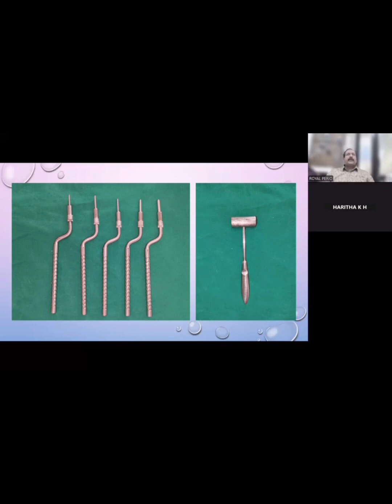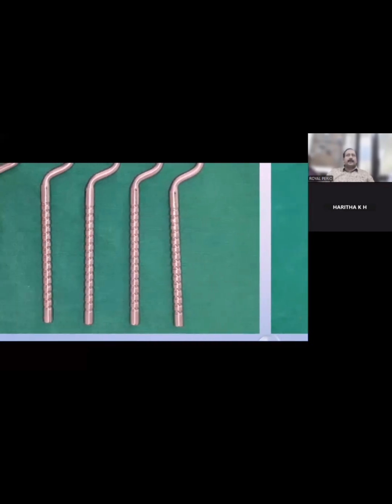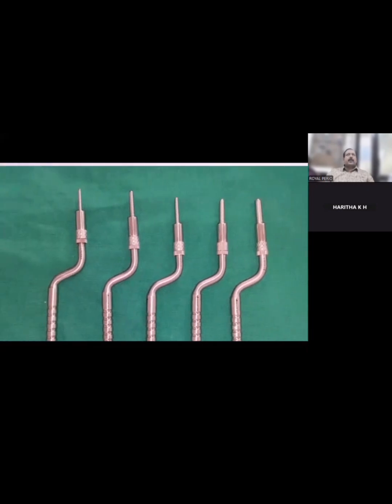So how would you fix that tip of it? Can you zoom and show how it is? Which is the third one? Yeah. So that has to be fixed to what height? 6, 8. You want to raise it till 8. Okay, 8 is fine. See, if you have raised the sinus floor any amount, then the length of that implant is your choice.